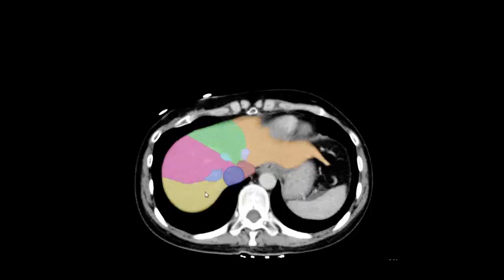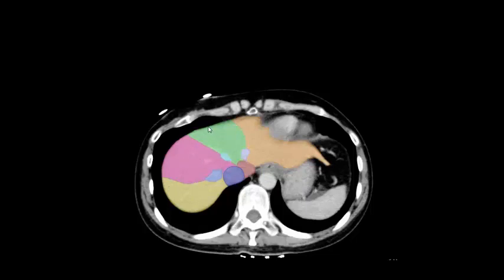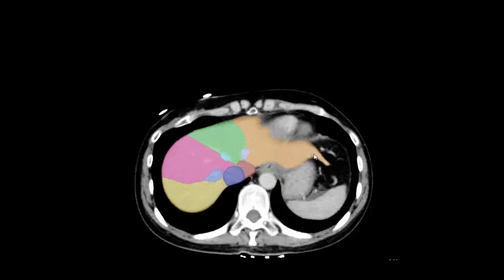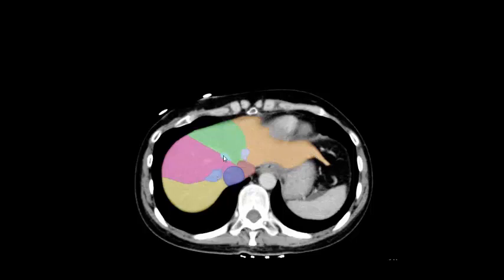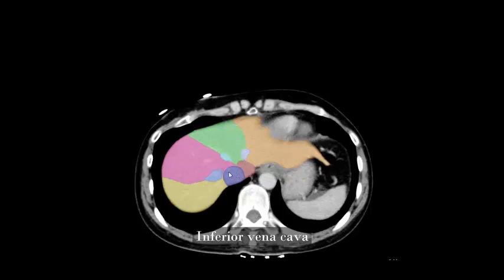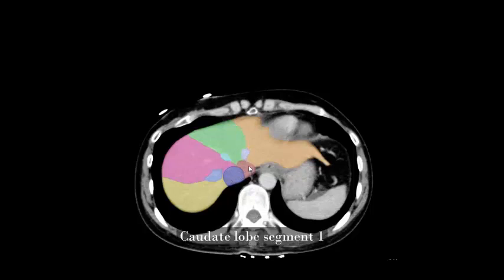Liver segment 8, liver segment 4a, liver segment 2, right hepatic vein, middle hepatic vein, left hepatic vein, inferior vena cava, caudate lobe segment 1.